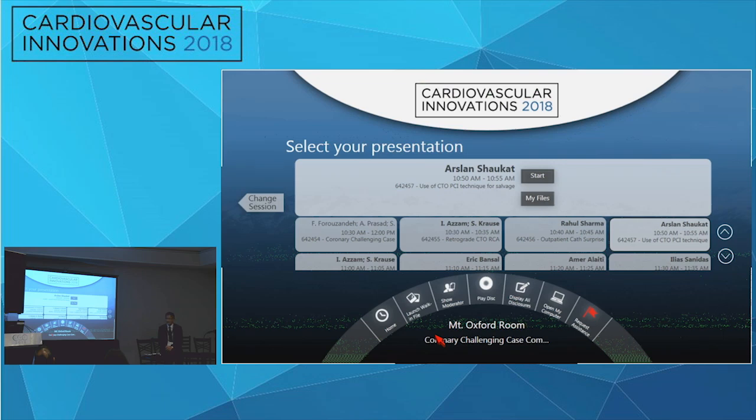Yeah, I agree. The few times that I've used it or scrubbed into those cases, I think it works well because it helps track the wire, sort of, like you said, sucks it in that way. And I think the other thing that commonly happens is that you tend to undersize your balloon when you're doing a reverse CART, so I think an appropriately sized balloon also helps. If it's undersized, you can keep trying over and over and it won't work.